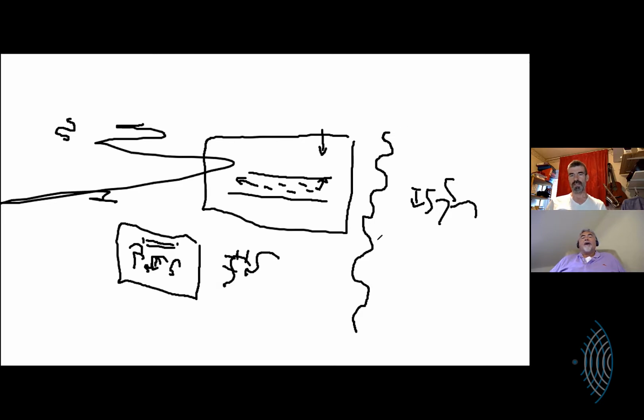So you have a sound wave that is 10 cycles long, so 10 10-millionths of a second, possibly slightly longer. And they fire off in the same way. You get one, and then another, and then another, all the way along your picture. That's why the size of your box is quite important, because the wider your box is, the longer it takes to update. These pulses go in, which is why the color has nothing like as good a spatial resolution as your grayscale picture. So the blobs are quite big on your color picture, and that's because they're made up of 10 cycles.